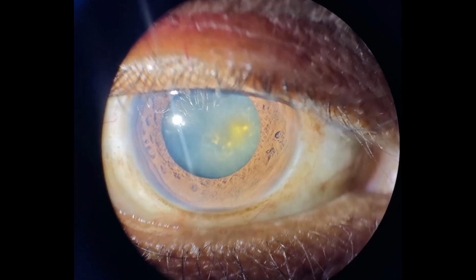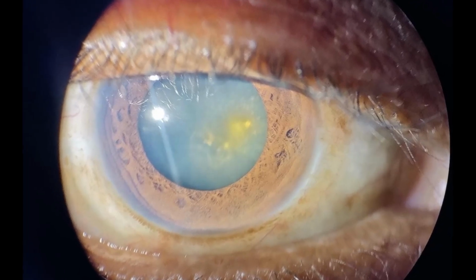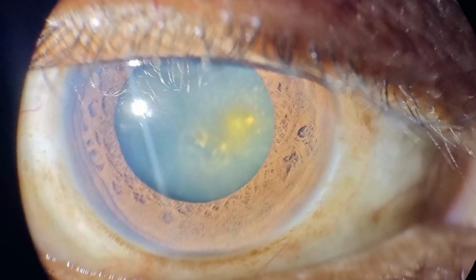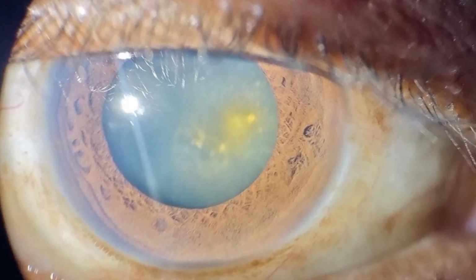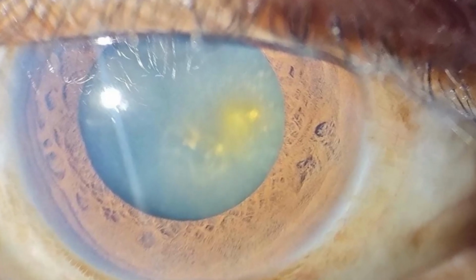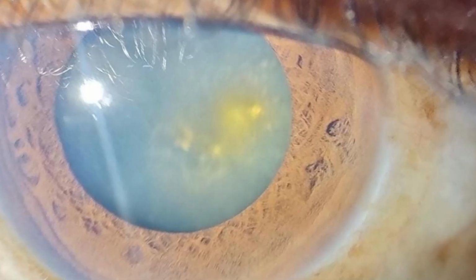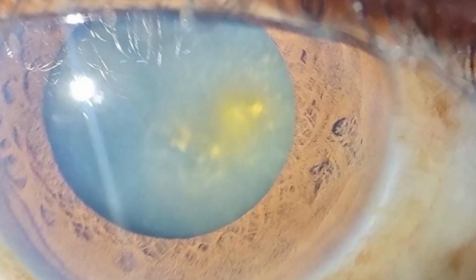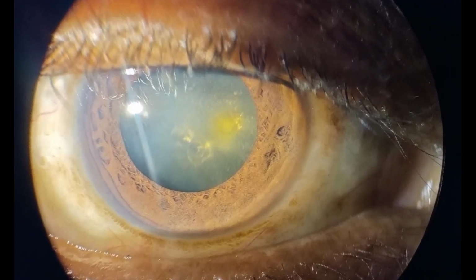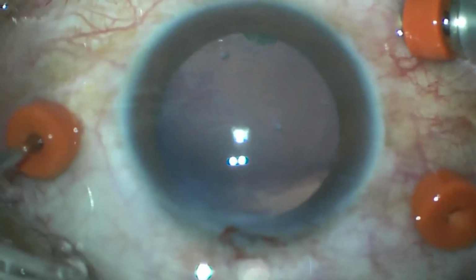Today we will see this case in which there was a retained intraocular foreign body, retained just behind the crystalline lens. It has perforated the cornea, the lens and the posterior capsule, and was retained in the anterior vitreous. As you can see, this is the area where the foreign body has punctured, and this is another photograph which shows the anterior capsular defect.